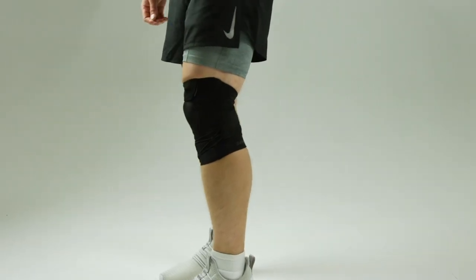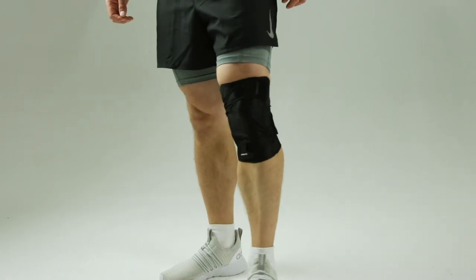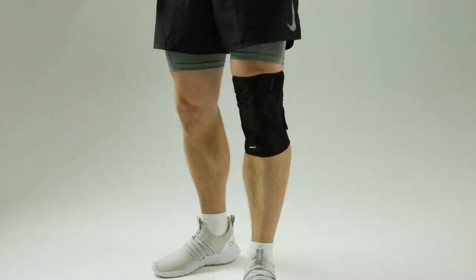Make sure that the product is not loose or out of place. If you feel any discomfort, repeat the steps from the beginning to reapply the product.